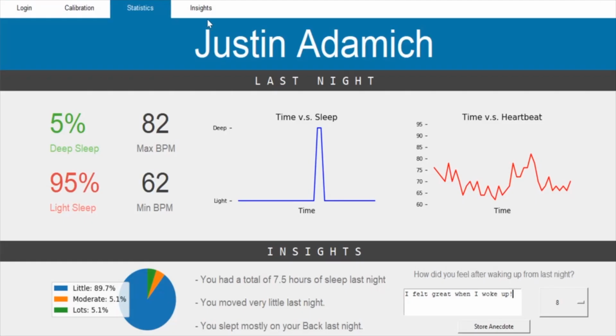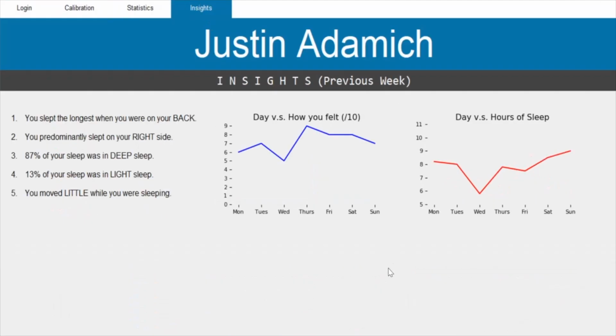So finally, the user can go to the Insights page. This page will give you some more long-term data. So here we're looking at the previous week's data. It shows you how you felt when you woke up for the whole week and how many hours of sleep you got. And also some more interesting things such as throughout the week you moved very little when you were sleeping. You had a certain percentage of time in deep sleep, a certain percentage in light sleep, whether you predominantly slept on your right side, your left side, or your back.